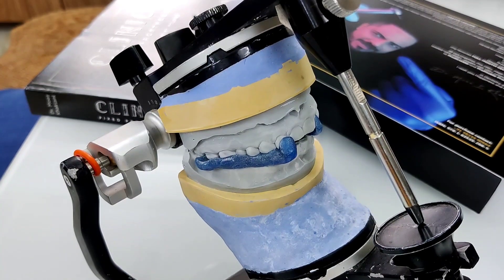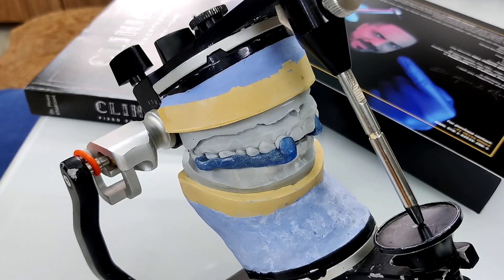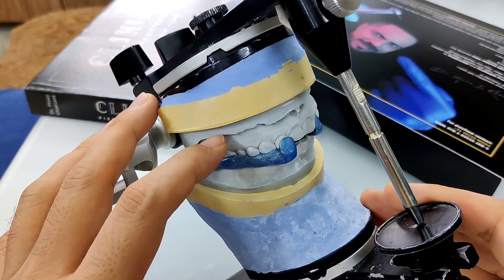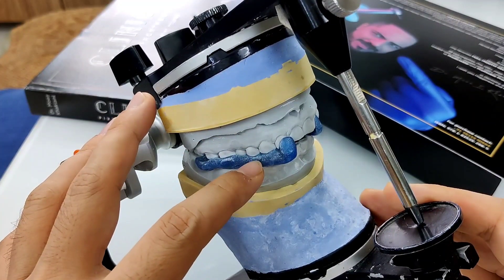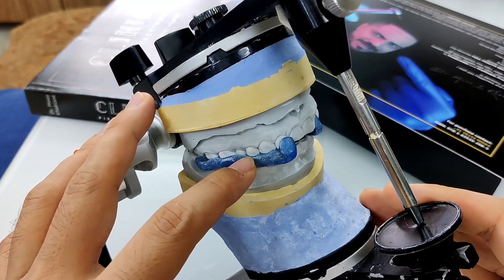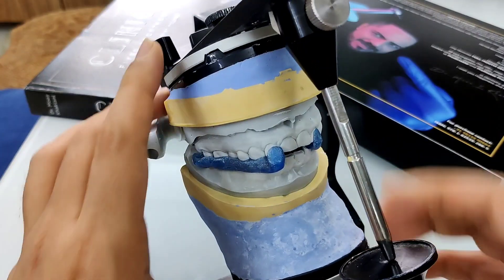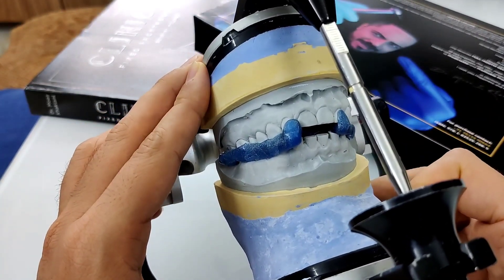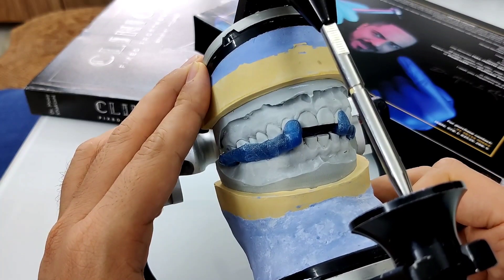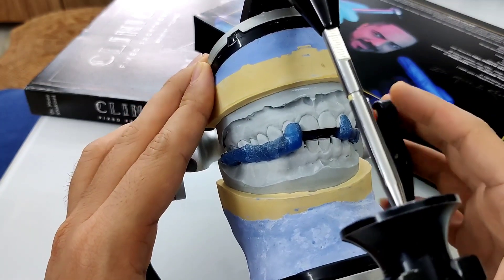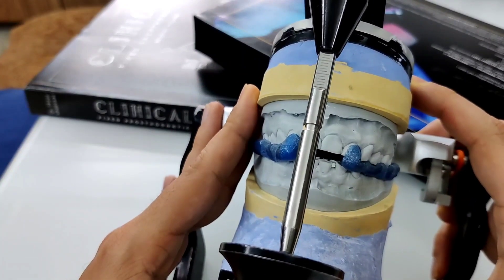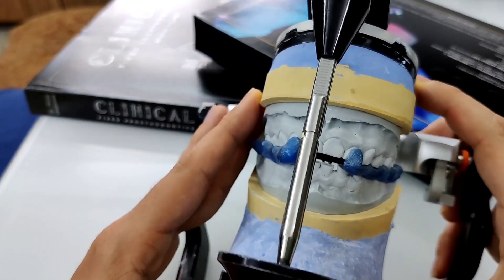This is a patient who needs a full mouth reconstruction and we have mounted the cast on a semi-adjustable articulator. The maxillary cast was mounted with the help of a face bow record. The mandibular cast is mounted with the help of this centric relation bite, which was made at an increased vertical dimension because we used an anterior deprogrammer in the form of Kois NM to allow the condyles to go into their musculoskeletally stable CR position.